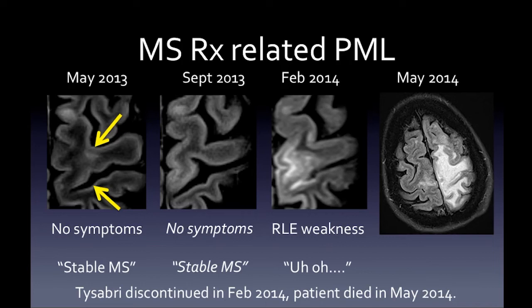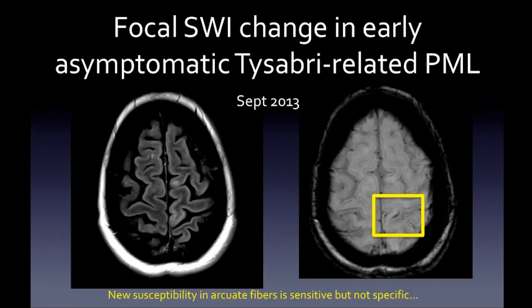Going back to 2013, you could see progressive changes in the subcortical and juxtacortical white matter. An important early sign: focal SWI (susceptibility-weighted imaging) changes can appear early in asymptomatic natalizumab-related PML. In MS patients on natalizumab or other immunotherapy, rapid development of new SWI signal changes in arcuate fibers should raise concern for developing PML. SWI signal changes can be seen in old MS plaques, but it's the rapid development of new SWI changes in a new lesion that is the red flag for PML.